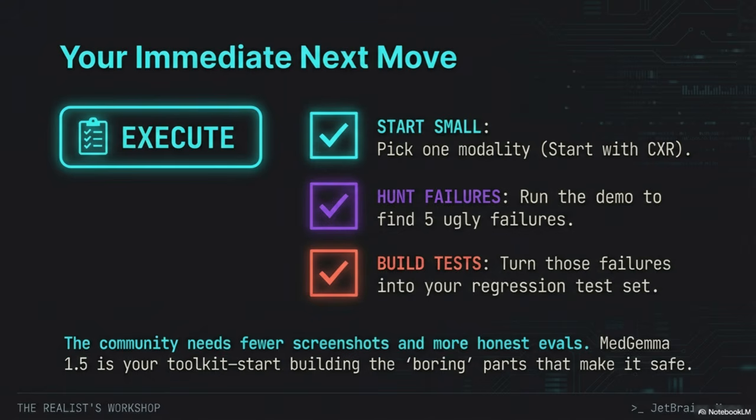Okay, so here's the final provocative thought for you to consider. We've established that the model can only reason over the specific slices or patches you feed it. The real engineering challenge moving forward is not the model itself. No, it's designing that smart pre-processing layer that reliably selects the most diagnostically relevant information while managing that context budget. So the question is, what selection criteria, like integrating an existing segmentation map or using anatomical filtering, what would you focus on building first to solve that input problem?